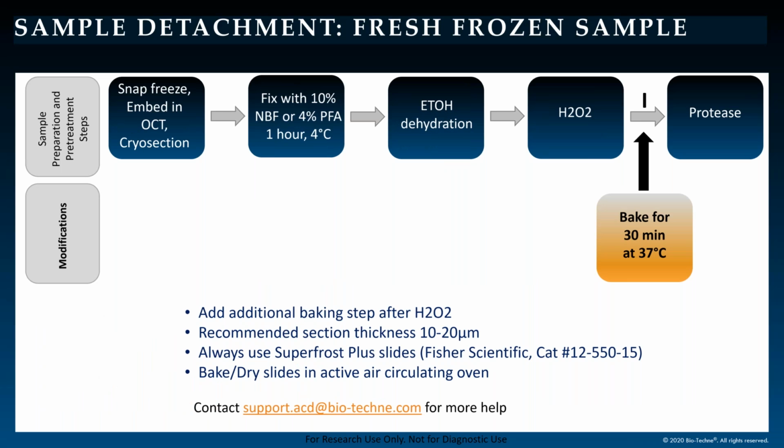For sample detachment issues with fresh frozen tissue, we recommend extending the post-fix duration to 1 hour at 4 degrees, and also including a baking step at 37 degrees for 30 minutes. If you continue to experience issues with detachment or other issues as mentioned earlier, please contact technical support for additional guidance.